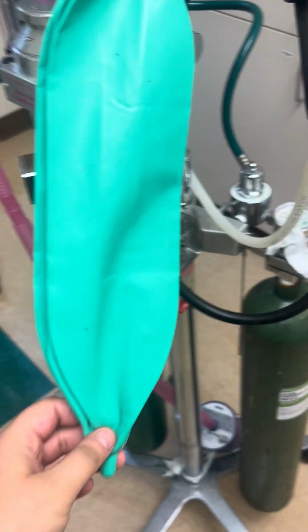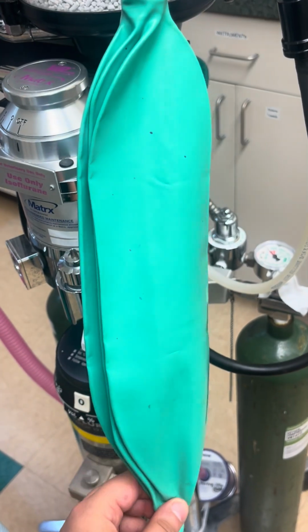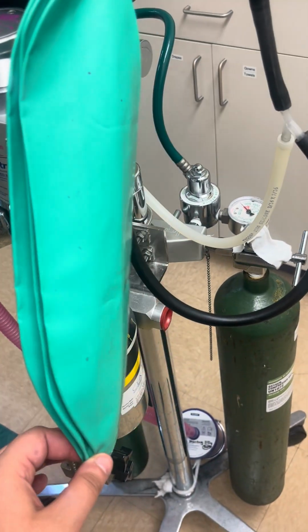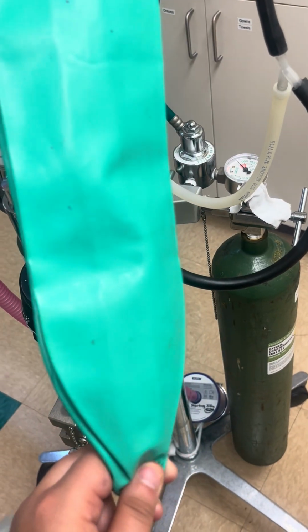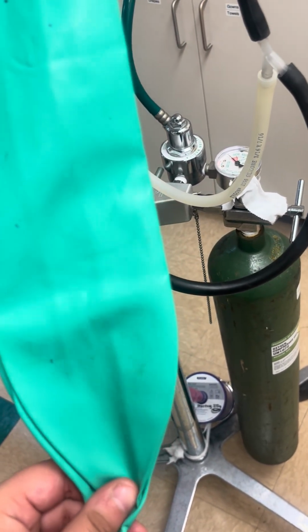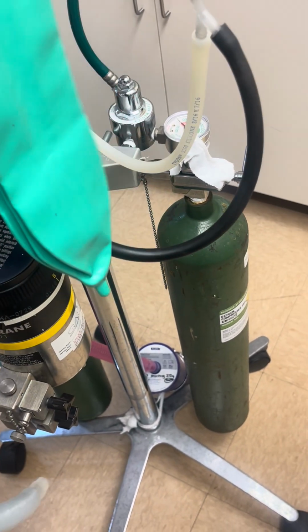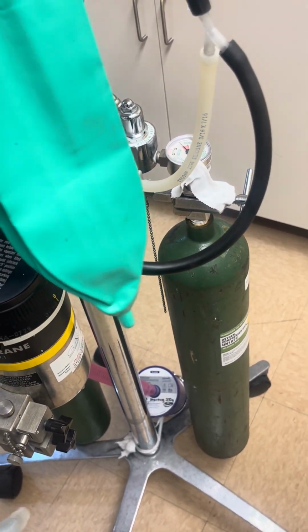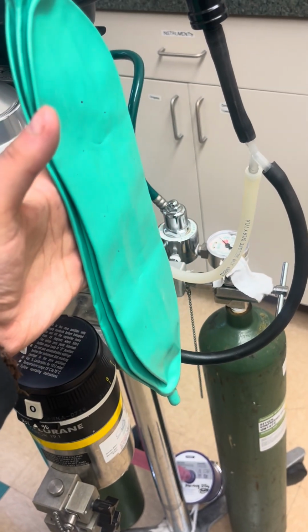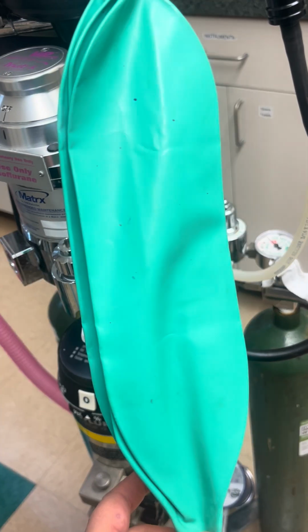Right, and then the 10th step is our reservoir bag. So this stores gas and O2 to provide a consistent supply to the patient that is not used via inhalation. It is an indicator of the patient's respirations and lung function. So when you exhale, it'll inflate, and when you inhale, it'll deflate. And there are sizes.